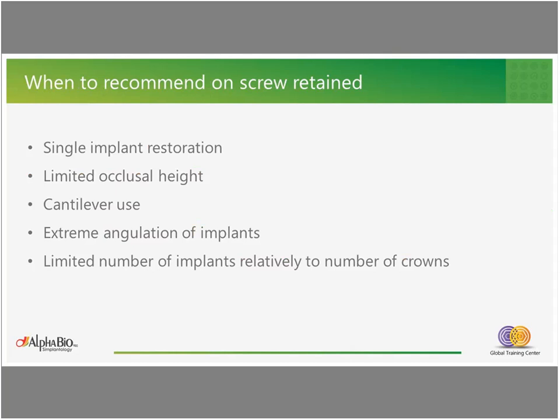retrieve the restoration and make it easy to maintain the implant-supported prosthetics, especially if we have screw loosening. It will be much easier to take out the abutment and the crown together and make tightening or rescrewing of the restoration back on the implant without the need to retrieve the crown. This mission will be much more difficult if we have a cemented restoration on a single implant.